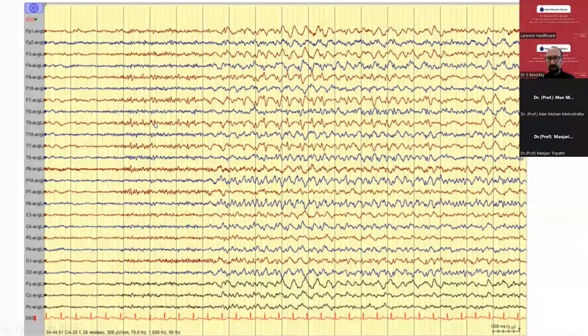You know, in our country, in Denmark, the political parties have the same color code. Our left-wing party, so the communists, usually get a red color in the parliament, and that's why we give the left-sided electrodes also the red color. And then the conservatives in our country, they use the blue color, and that's why our electrodes on the right side come also in blue color.